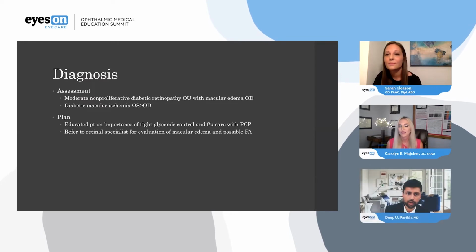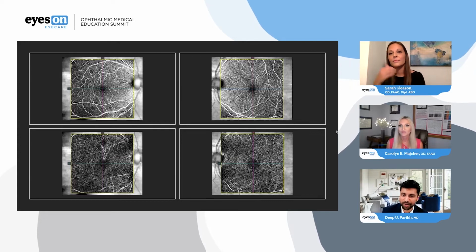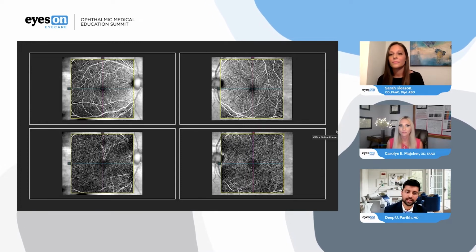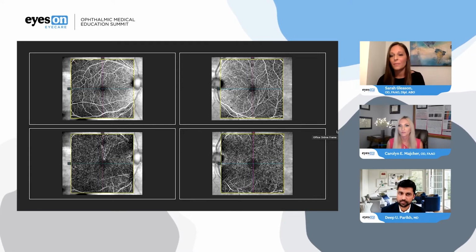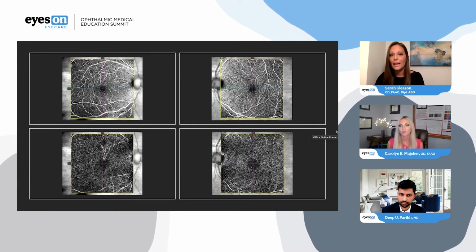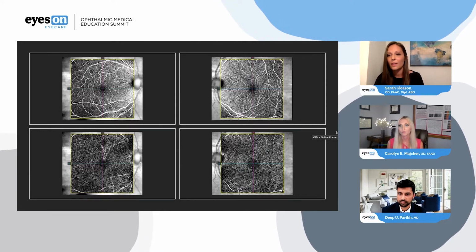Sarah, quick question. Are you routinely getting OCTs, OCTA, but also just regular OCTs on your mild NPDR patients and moderate ones, or are you sort of waiting till they become more severe in retinopathy? So years ago, I kind of was waiting. I didn't always think it was necessary if I wasn't seeing much retinopathy, especially in the area of the macula, to obtain these images. But now that we have the ability to do OCTA, even if there aren't hemorrhages or exudates present centrally, I really like to get a regular OCT and specifically an OCTA to look for this area of ischemia.